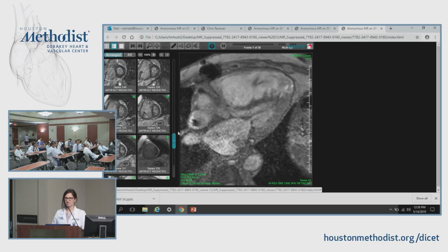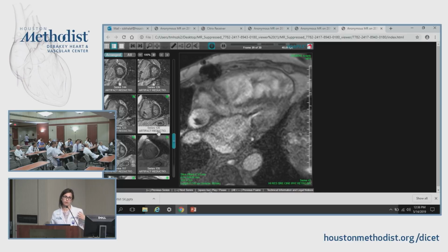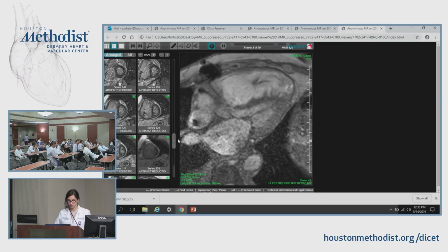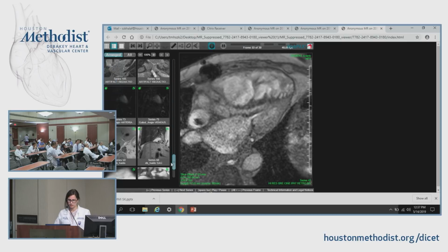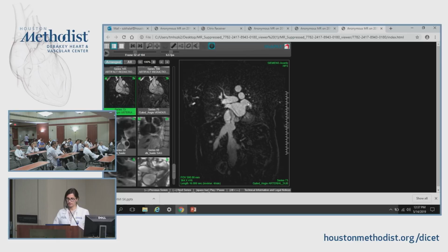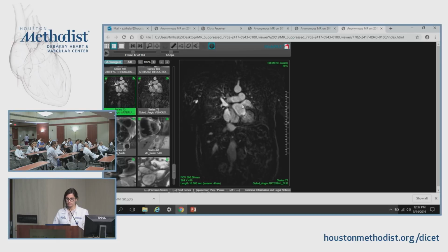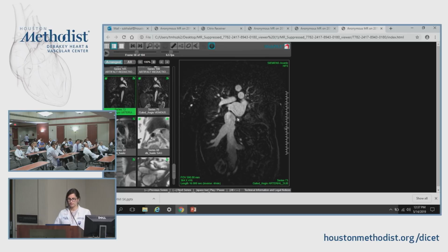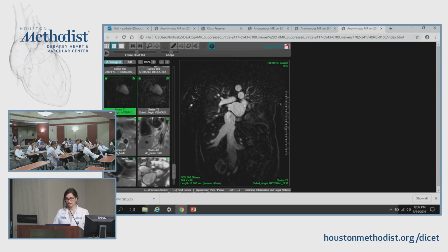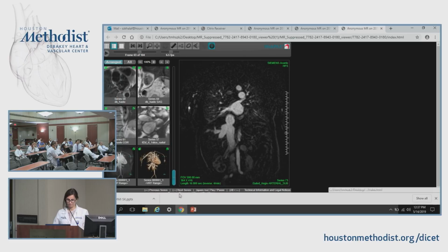Based on the chest x-ray, the pacemaker box was quite lateral, so this one was pretty good. We didn't see any delayed enhancement. What's really impressive here, we talk about hepatic reflux. This is our arterial phase, so technically our venous system should not be opacified, but we can see the contrast in the IVC is equally as bright as in the aorta. So, okay.